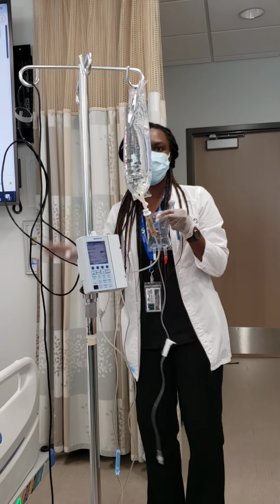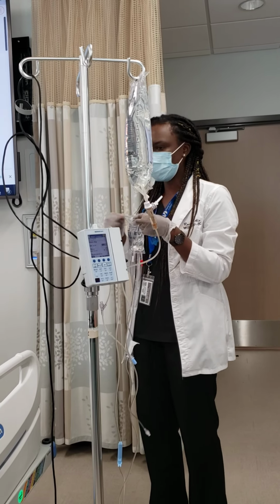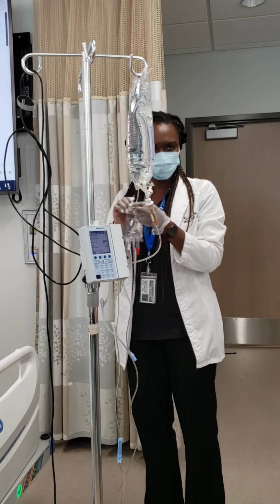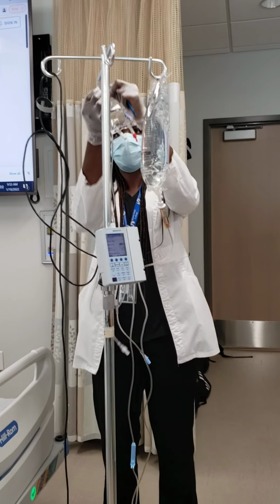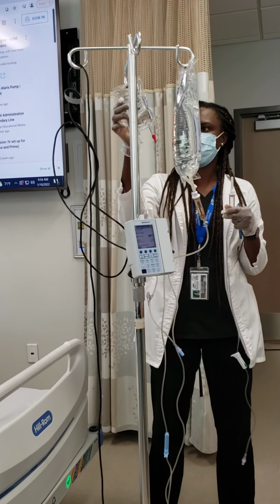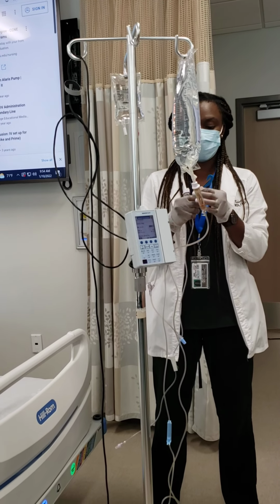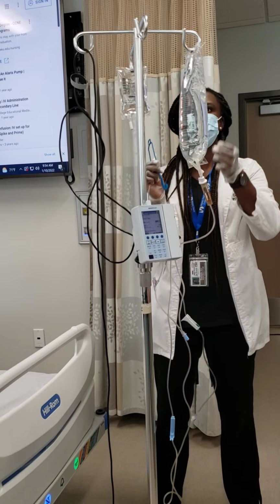You check your orders, did your six rights: right patient, right dose, everything. You came in, you washed your hands, and everything is to the T, right? All you do is get another set, put your bag, of course you've already checked your expiration date, etc. So now, what you can do, you can actually take this.